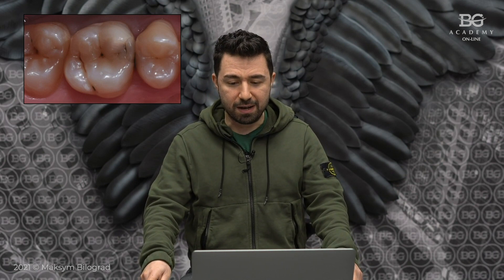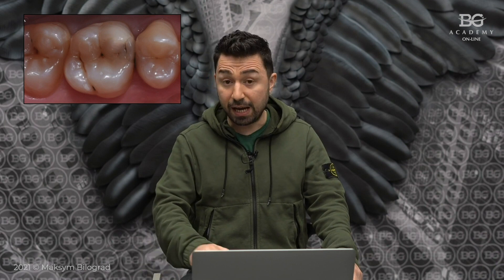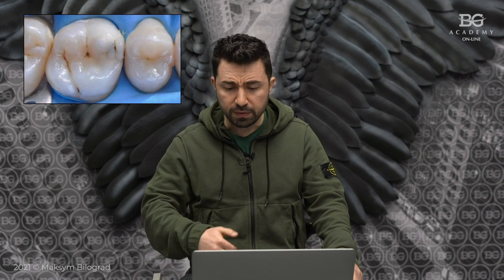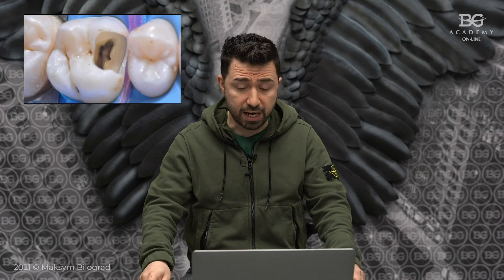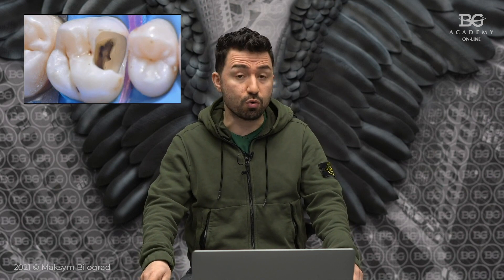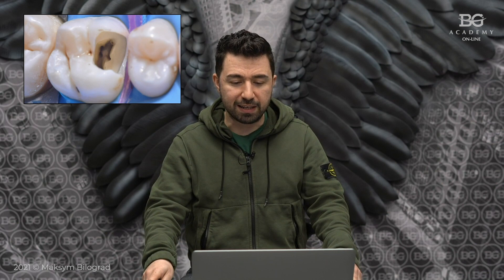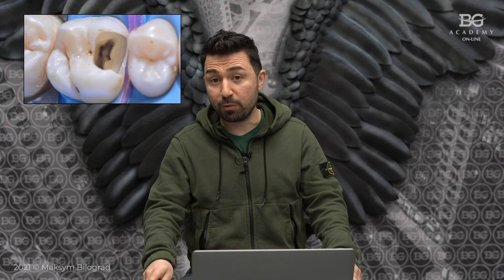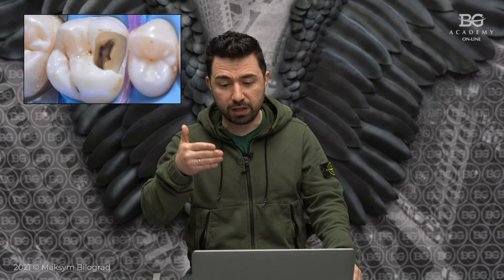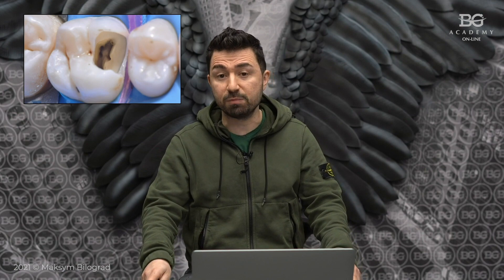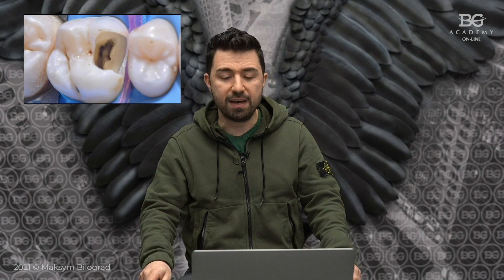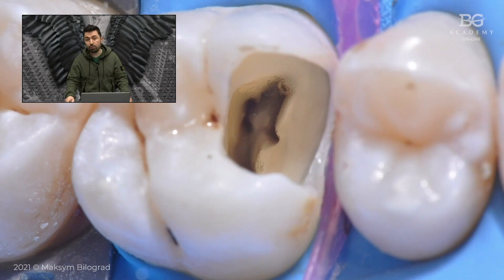We have irreversible pulpitis of an upper first premolar and the patient has very acute pain. He came with a big cavity. I isolated with a rubber dam system and we started to excavate caries and to open the pulp chamber to get endodontic access. One clinical tip I would like to share: you can see the wedge that I placed between the teeth, and the wedge helps you to protect the rubber dam during the process of preparation.